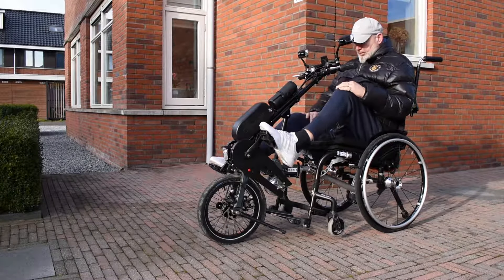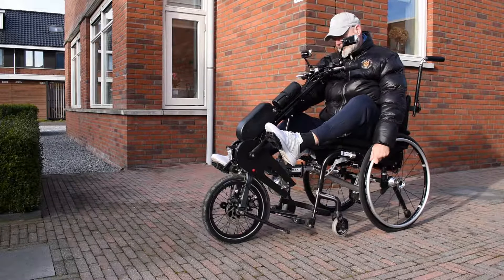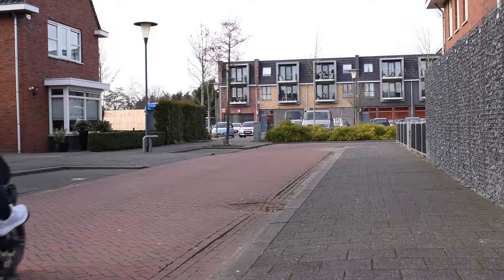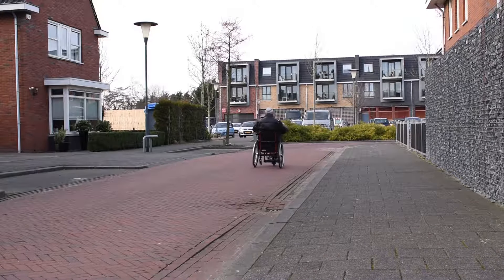A wheelchair is a useful invention, but it also has a disadvantage. Your legs are no longer used at all, whilst it is precisely in your legs that the largest muscles are located. This is why physical fitness declines unnecessarily quickly when people become wheelchair bound.